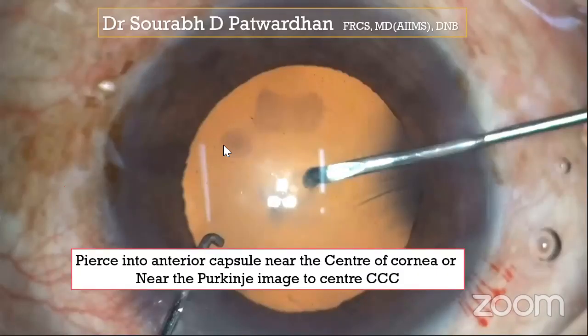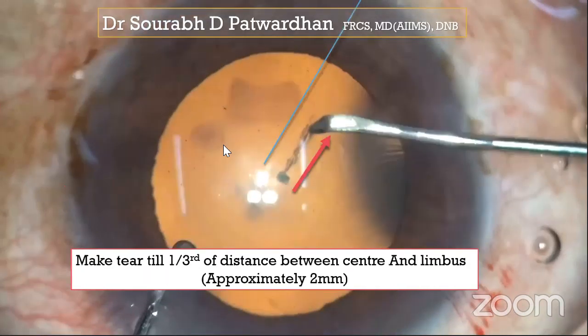To begin with, pierce the anterior capsule near the Purkinje image or at the center of the limbus. I will show later how to use a capsulorhexis marker as well. And after piercing, make around a 2 millimeter radial tear.